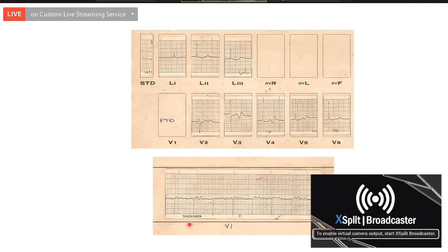Okay, it can be a cardiomyopathy type of picture, yes. But usually, is atrial fibrillation in cardiomyopathy a coarse atrial fibrillation or a fine one? Fine, because the LA will be damaged. Yes, atrial fibrillation in a patient with dilated cardiomyopathy usually will be a fine atrial fibrillation. What are the situations where you can get a coarse atrial fibrillation?